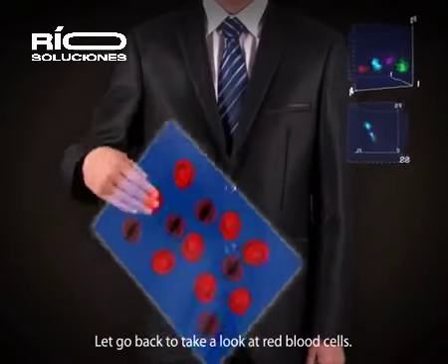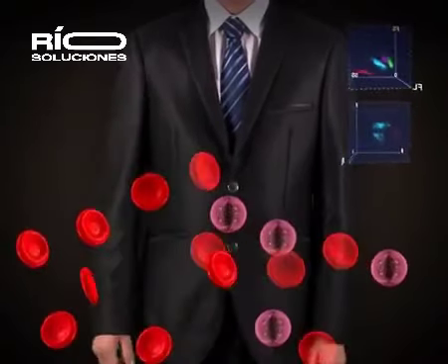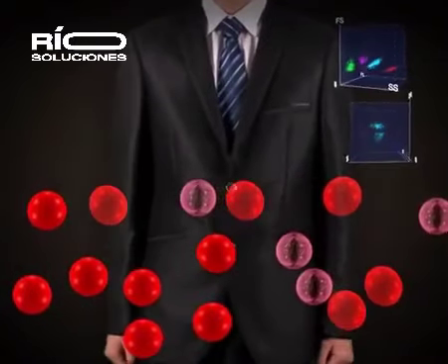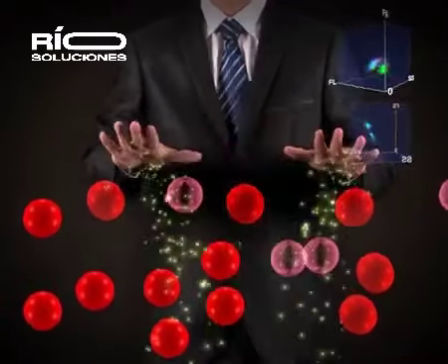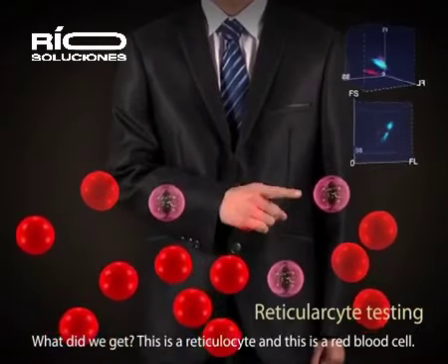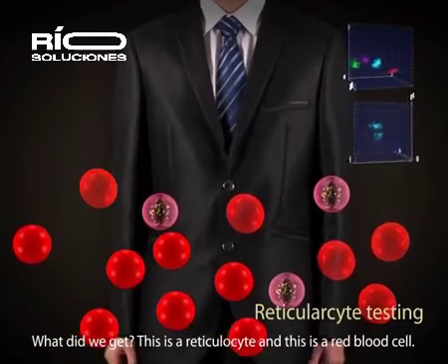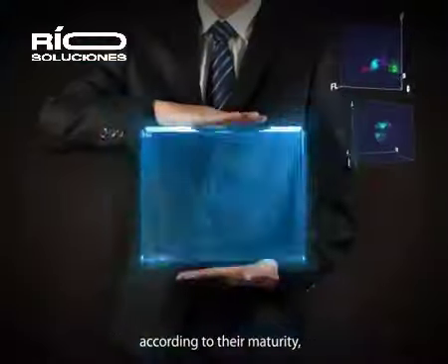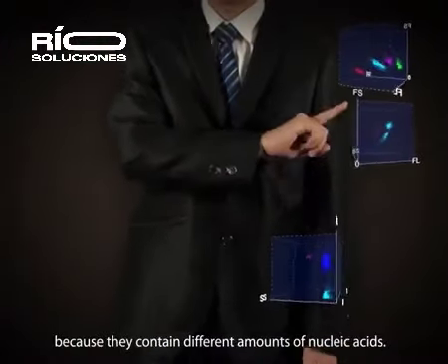Let's go back and take a look at red blood cells. Firstly, we sphericize all red blood cells. What did we get? This is a reticulocyte, and this, red blood cell. Reticulocytes show different fluorescent intensity according to their maturity because they contain different amounts of nucleic acids.